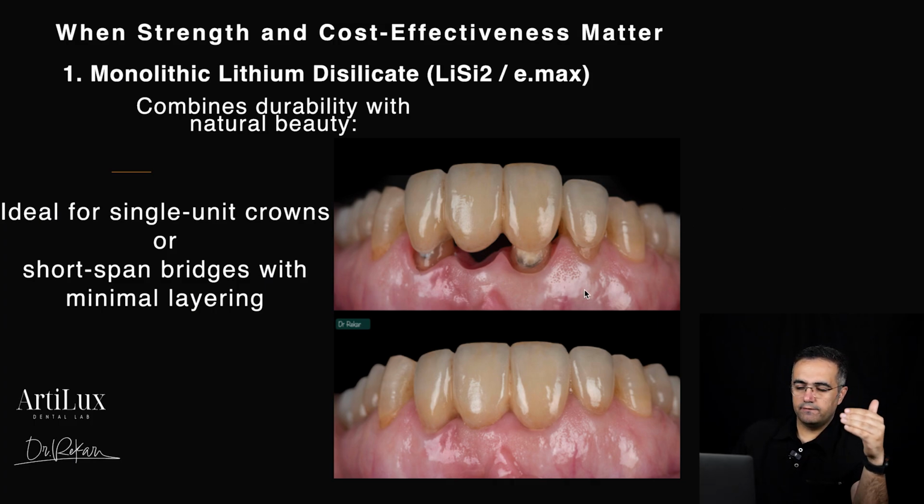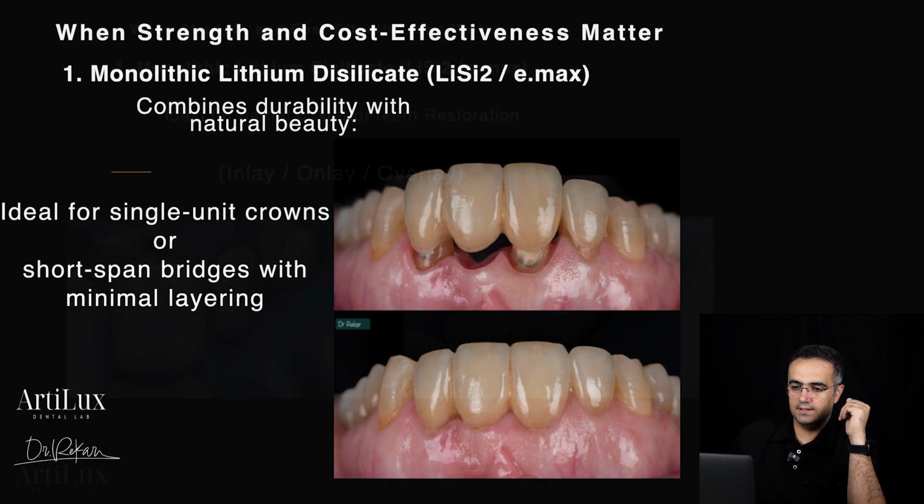So this is one of the cases, an old age patient and a very short span. There is not heavy force on it, so still I can use the monolithic lithium disilicate in this case.